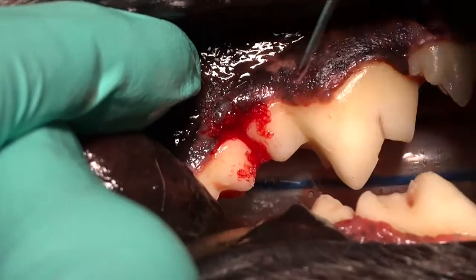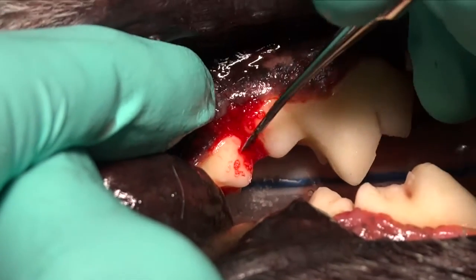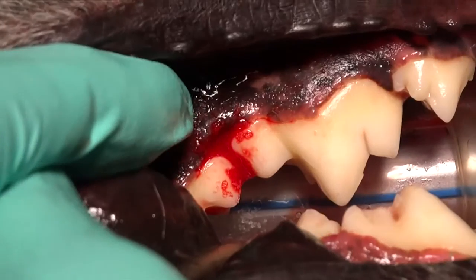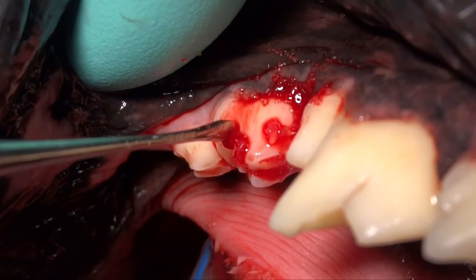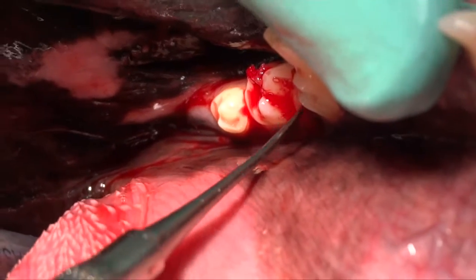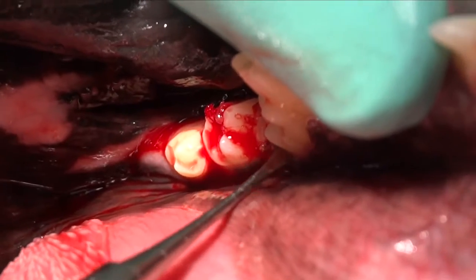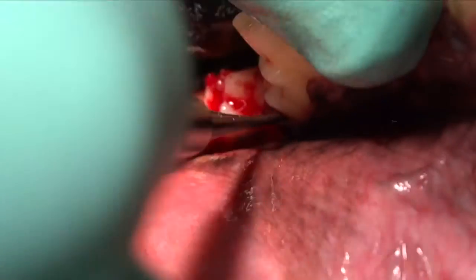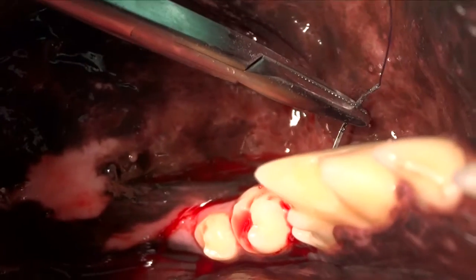That arrow is pointing to some of the granulation tissue that we got out of the defect, as you can see there. We're using the periosteal elevator to pack that bone graft down on the lingual side, making sure we've got good fill. We may at times need to open up the lingual side as well to expose and visualize the area in order to clean it out properly.